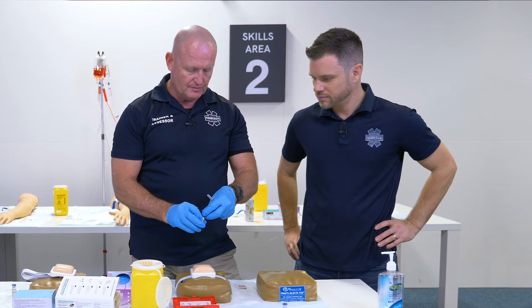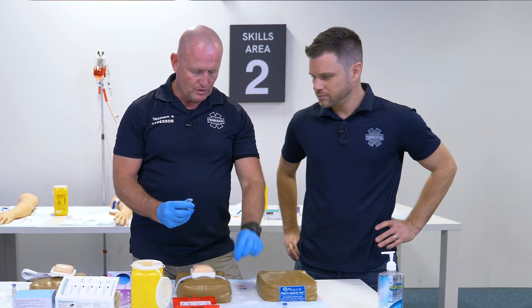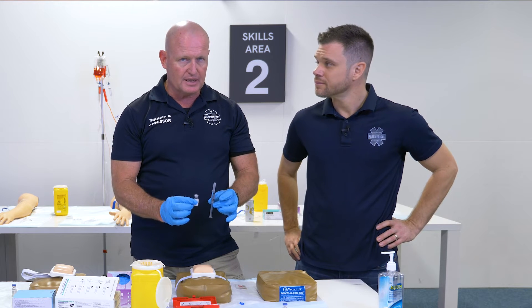It's got a safety cap on it. Take this little cap off — that's one for infection control, and two, to make sure this actually hasn't been tampered with.